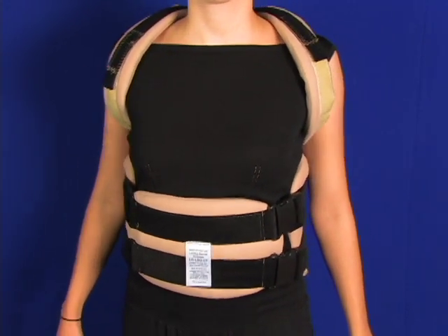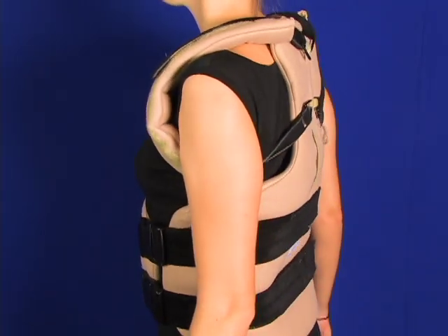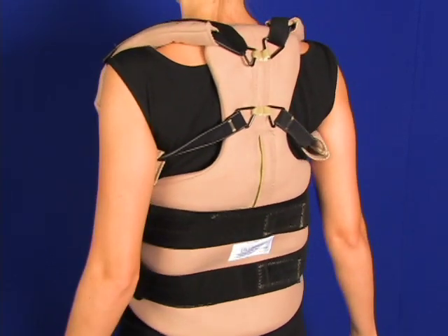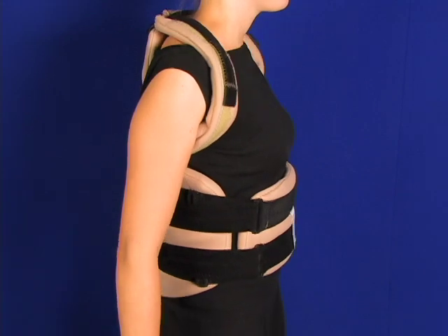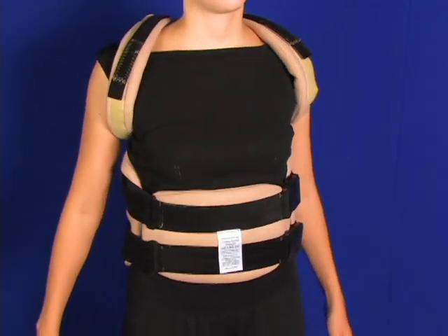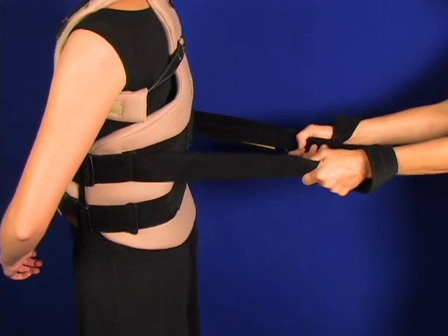Get a turnaround view to see the whole thing. The FlexiCore body should be adjusted to conform to the patient's torso. Small, medium, or large are determined by the height of the upper torso. And here you can see the straps that are used for gait training and gait assistance.